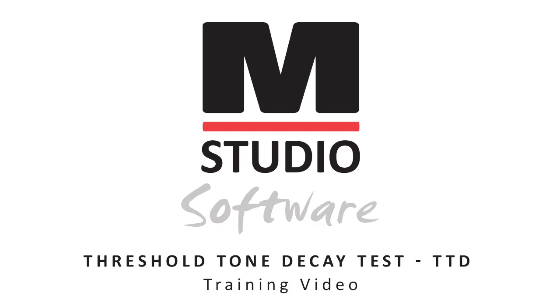In this video, we will review the threshold tone decay test and how to perform that test within the Medrex Studio software.